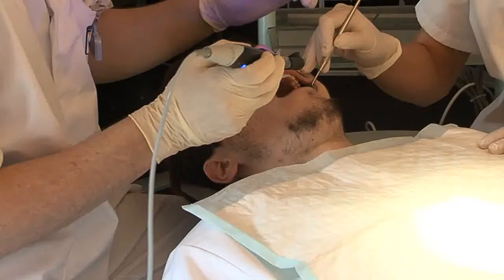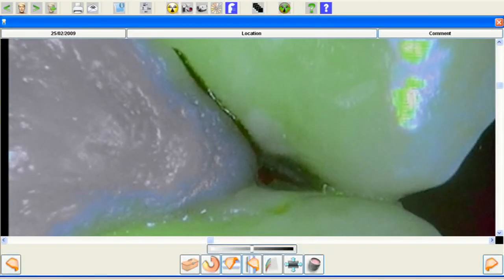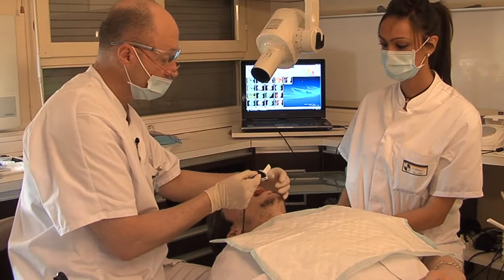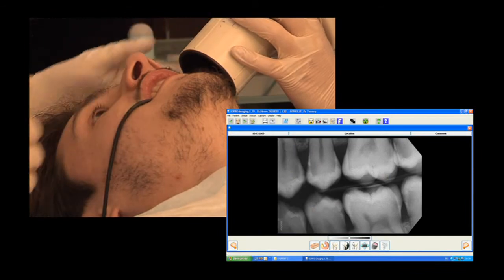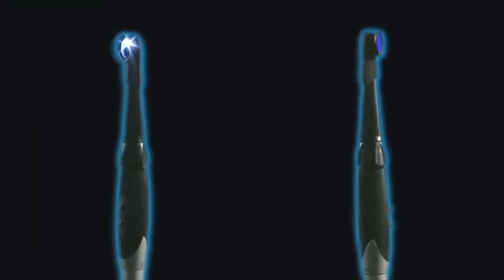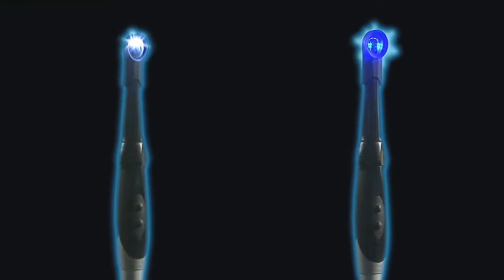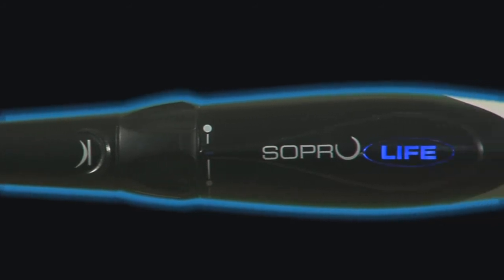With Soprolife's macro mode, you can magnify the image still further and make an even more precise diagnosis. Five years of technical, scientific and clinical research have allowed Sopro to put their skills and know-how in fluorescence imaging to the test. The result of this research is the development of Soprolife, a revolutionary device for the diagnosis and treatment of hard dental tissues.